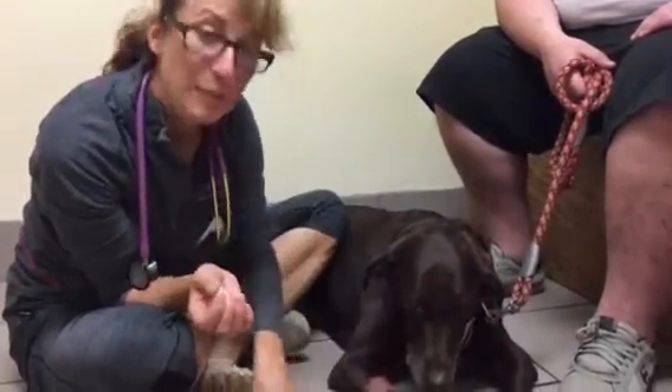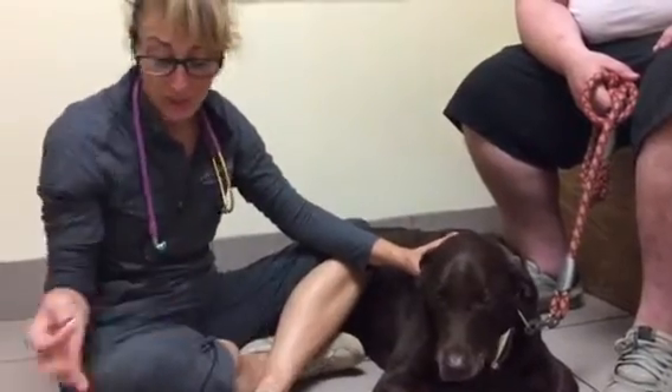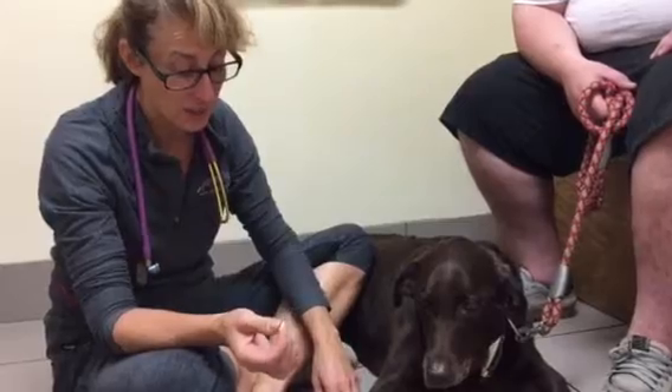Hi everybody, it's Dr. Magnifico from GR's Full Vet and potley.com. This is Ladybug. She's a diabetic. Somebody just donated a glucometer, so we're going to send it home with Ladybug's dad so that he can monitor her at home.